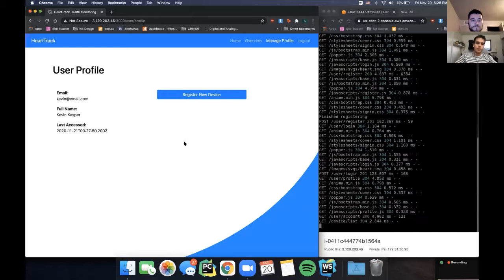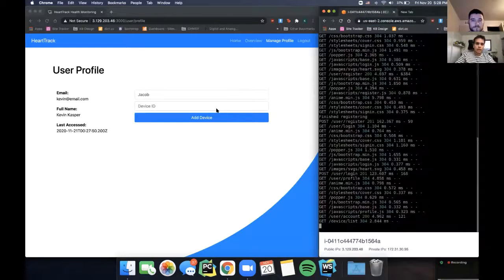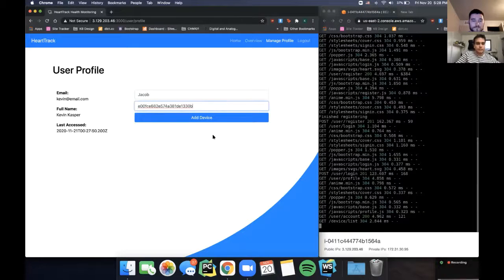And sign in. You will be immediately taken to the user profile page where you'll be able to see your information, including the last time you accessed this. At this point, we're going to go ahead and register a new device. We give all of our devices a friendly name to identify them. And we're going to go ahead and enter a device ID, which we've retrieved from the Argon device itself.